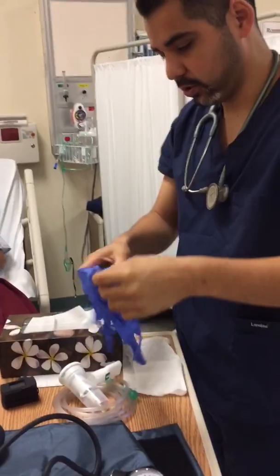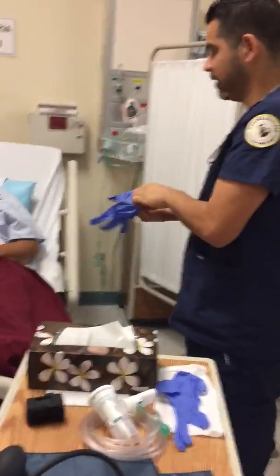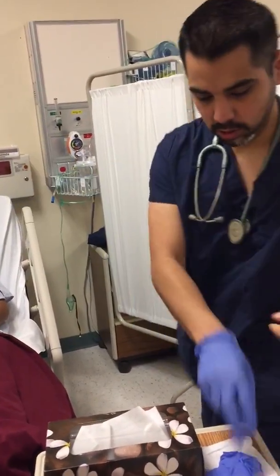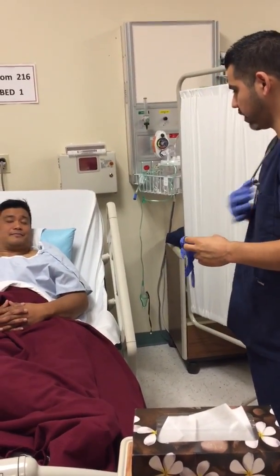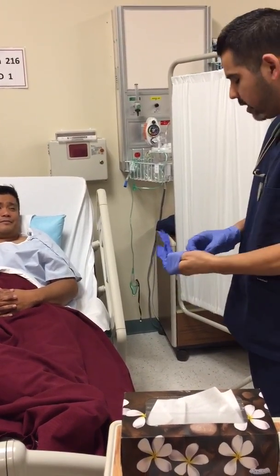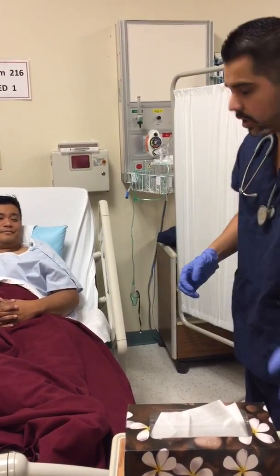Okay, Mr. Lota, I'm here today to be giving you. Or is it okay if I call you Richard? All right. Thank you very much. Sorry, I got your last name wrong. So today I'm going to be giving you a breathing treatment. I know you've been feeling some chest pain, and it's hard for you to breathe. Is that what I noticed? I read in the patient chart that you had really hard times of breathing and coughing anything up.